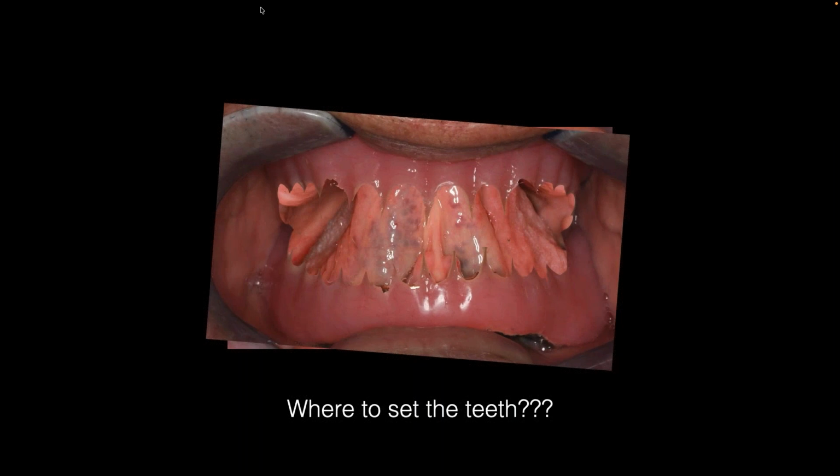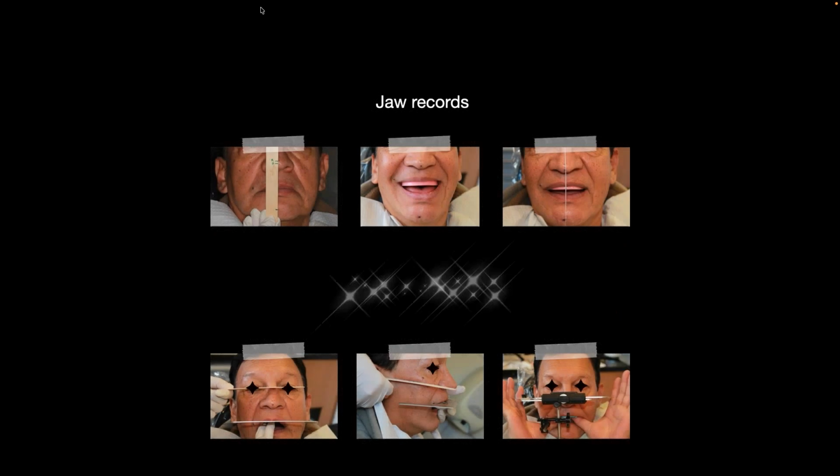Well, here's the thing. In order to know where to set the teeth, we need to first know what the teeth do. Based on what they do, we can determine where they go. Okay. But what about immediates? Patient already has teeth. Okay, fantastic. But you still have to check. You still have to check the position of those teeth.